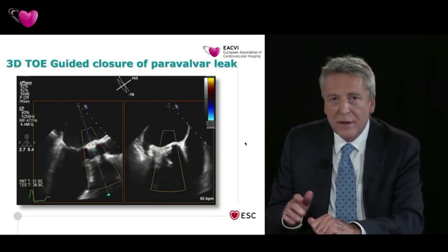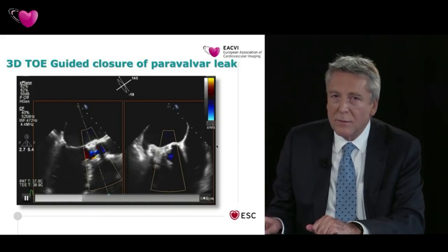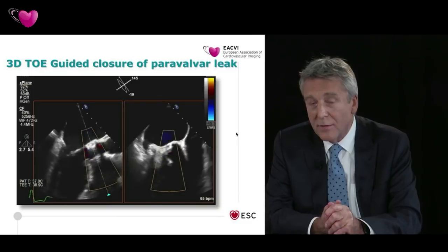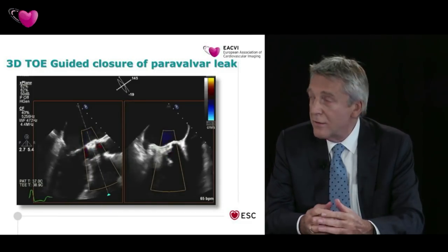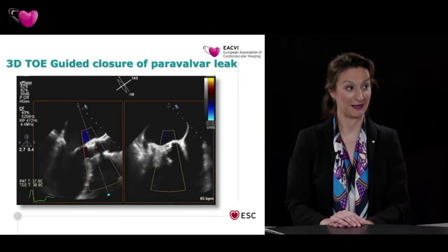And then this is the post-procedure images. So here is the closure device, and you can see that we've ended up with negligible paravalvular regurgitation now, so a very gratifying result. The patient did extremely well, went home a couple of days later and is still doing fine. Excellent. So that is really for very skilled labs, I think.